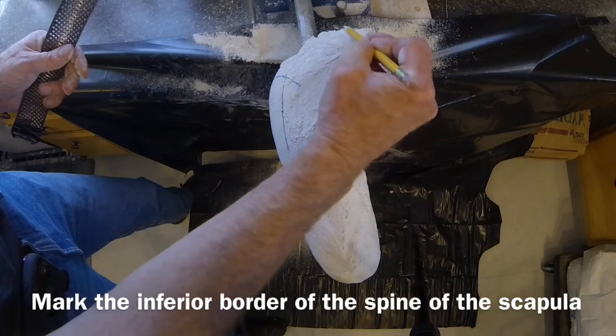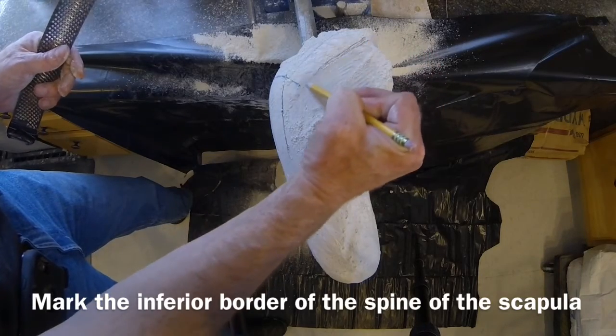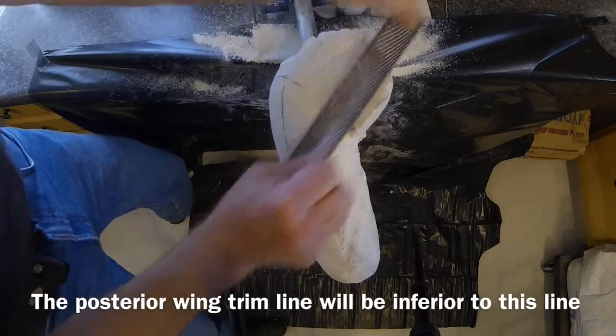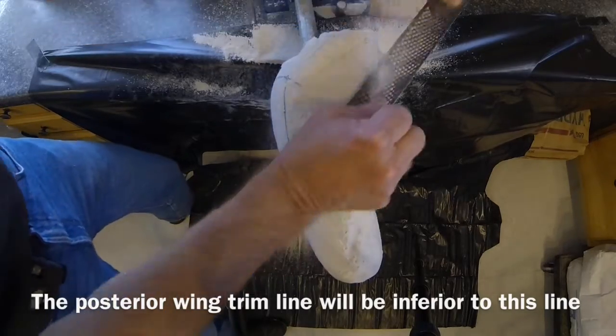The posterior wing modification will be focused inferior to the spine of the scapula, as shown.